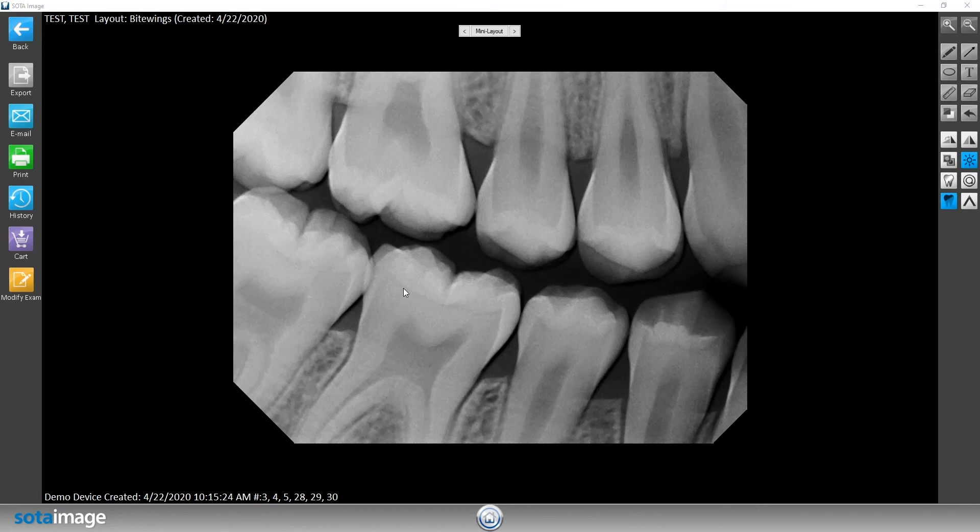In this video I'm going to be going over our filter tuner. The filter tuner is basically a setting inside of our software where you're going to be able to manipulate the strength of the actual sharpening filter. How you would get into that setting is by going into this tent-looking icon.